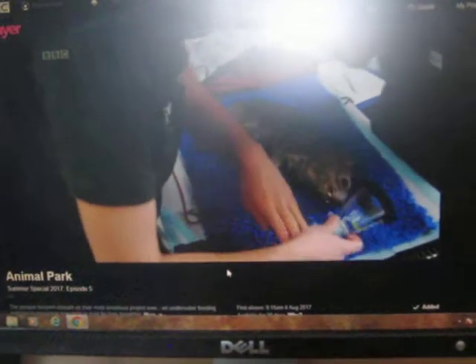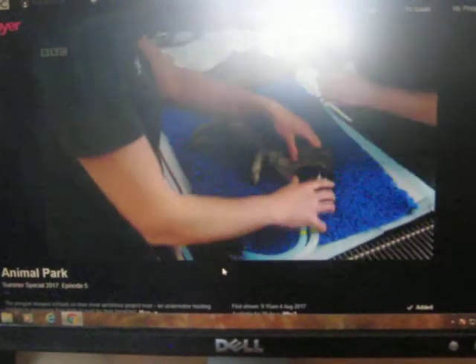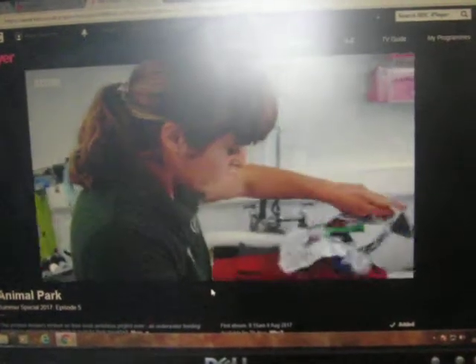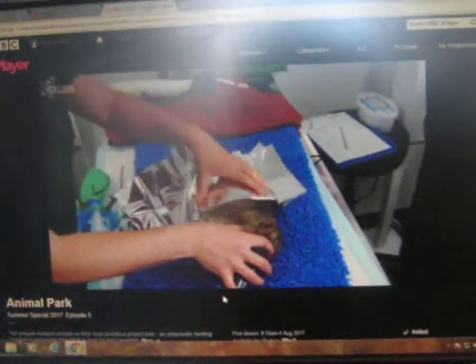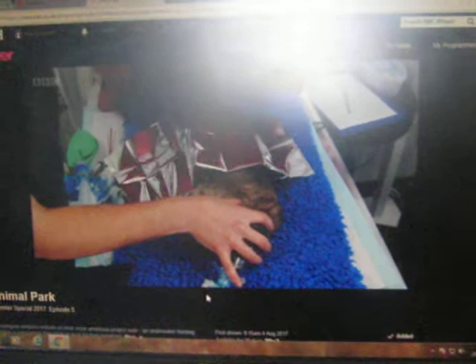We'll give him a little bit of oxygen for a minute. It's really important when we anaesthetise any animal, particularly the small ones, that we keep them warm while they're asleep. They'll lose an awful lot of heat once they're anaesthetised. So we use this space blanket like runners use, and we'll also cover him up with a heated blanket.